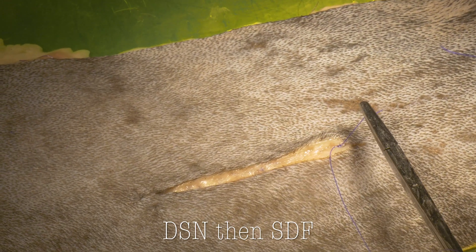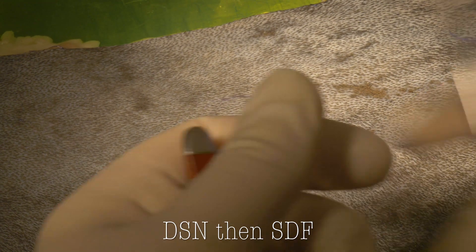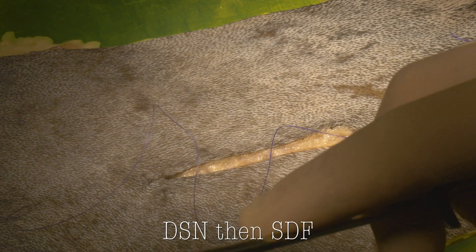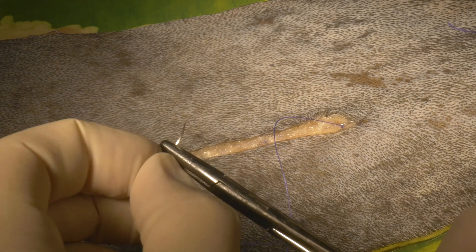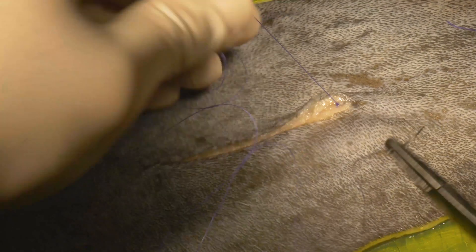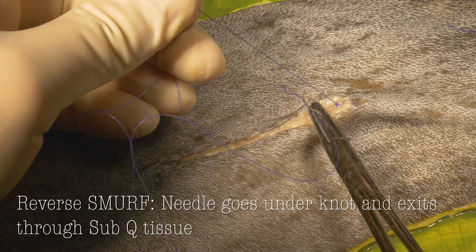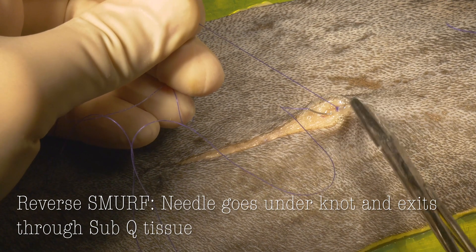We'll then cut the tag short. And now we're going to do what I call a reverse smurf. We're going to engage our needle in the needle holders backwards, pointing towards the beginning of the incision. Then I'm going to pull up on the suture and pass the needle under the knot, coming up just behind the knot through the subcutaneous tissue at the end — or beginning — of the incision.